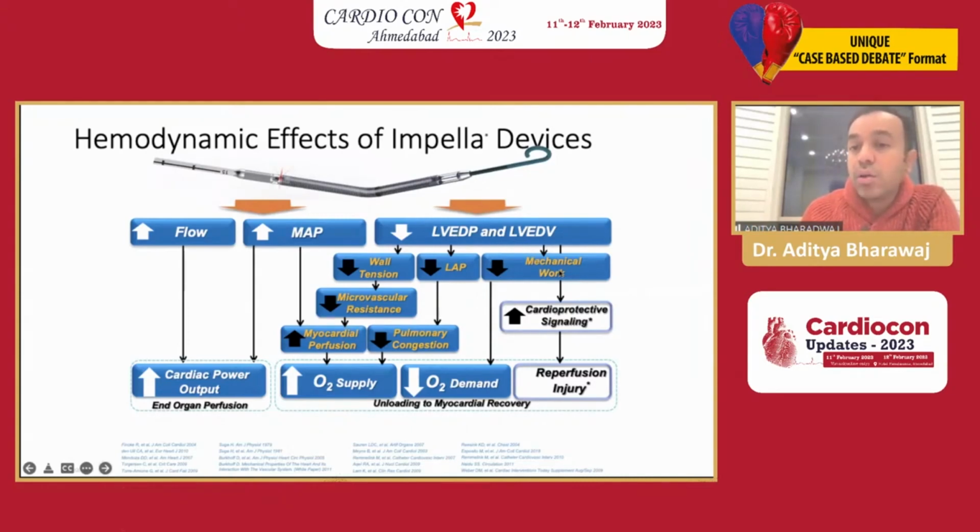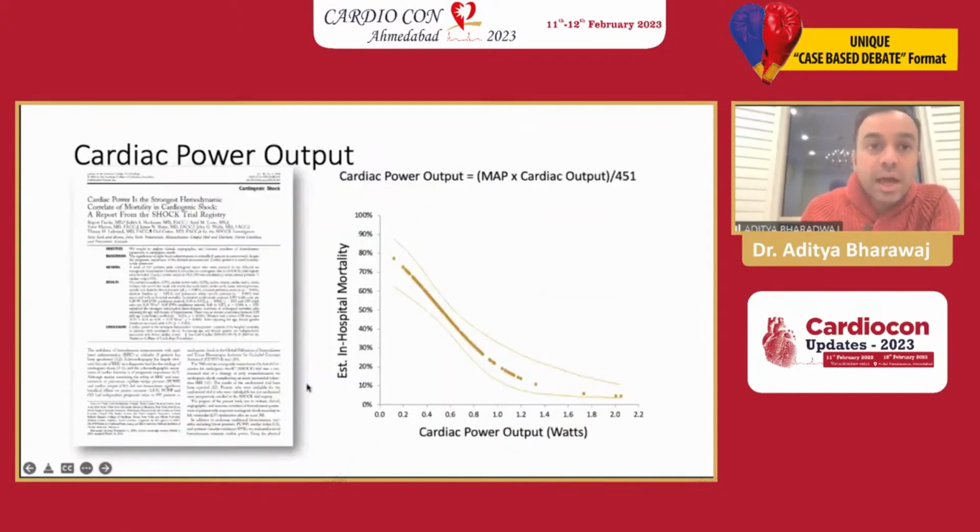Additionally, Impella also decreases the mechanical work of the heart, as a result of which the myocardial oxygen demand is further reduced. And I am going to explain this in a little bit.